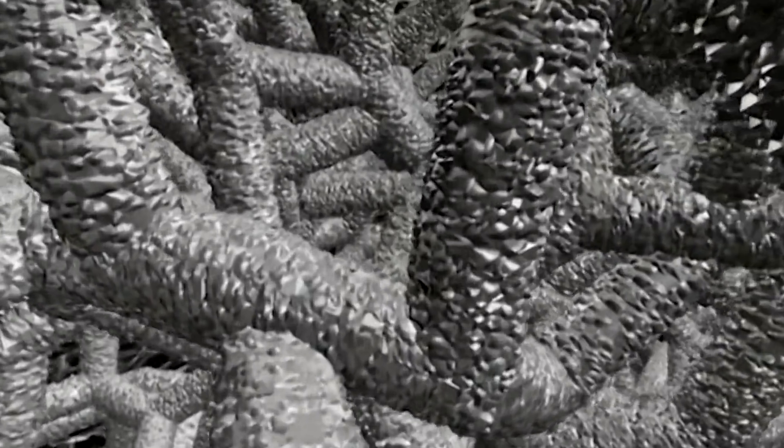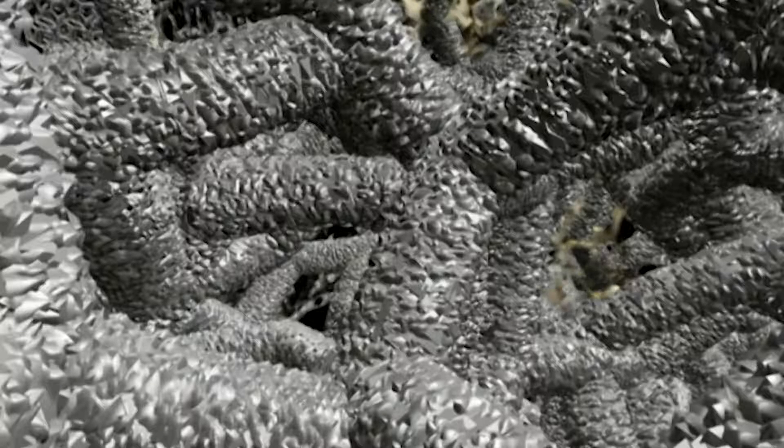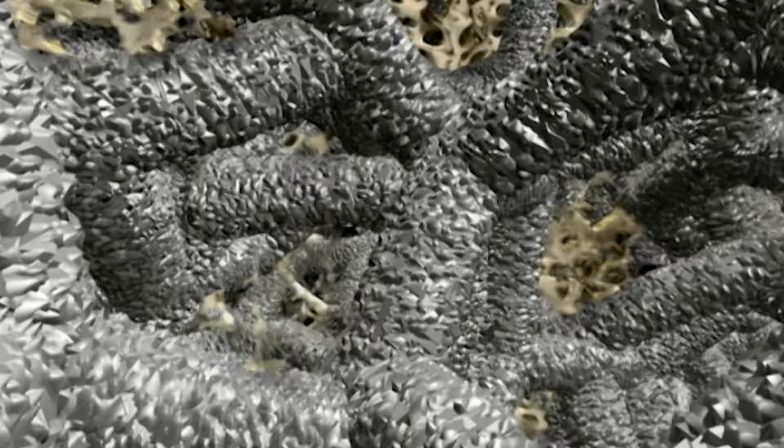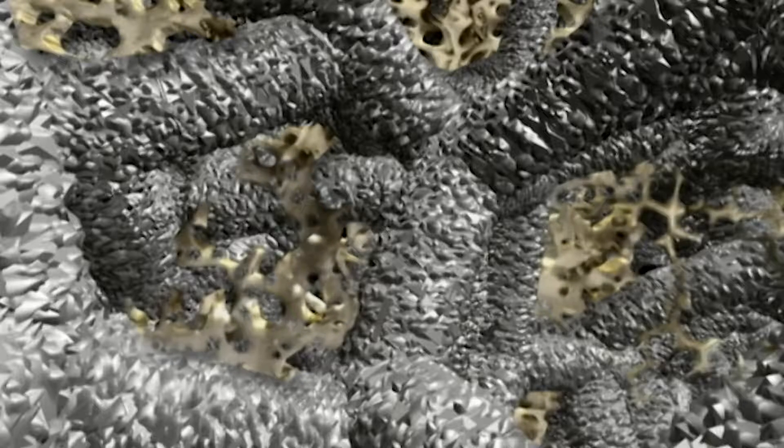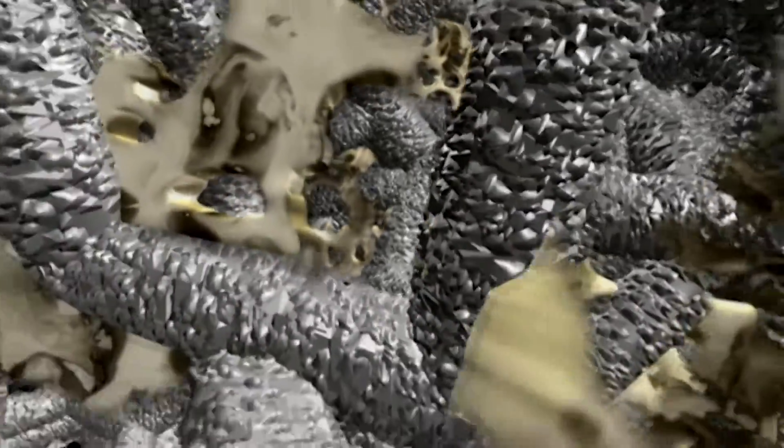Trabecular metal material has a high coefficient of friction against bone and fatigue properties similar to trabecular bone. This unique structure provides an excellent matrix for bone and soft tissue ingrowth. Tissue not only grows into the pores but interconnects.